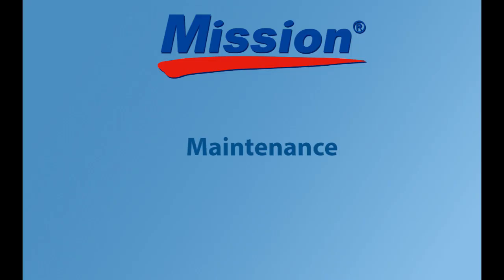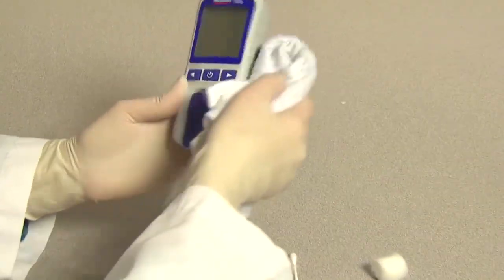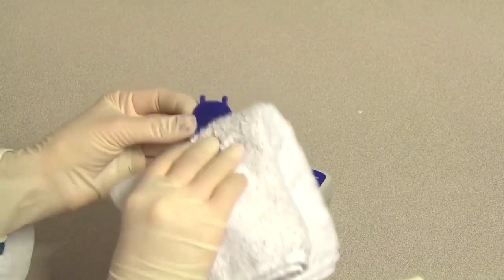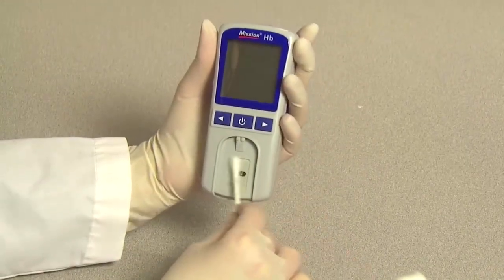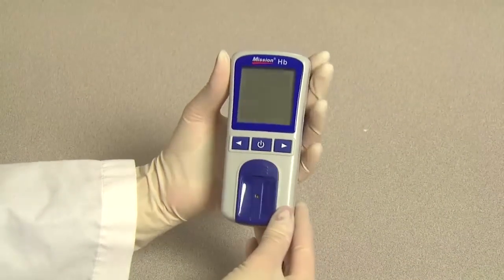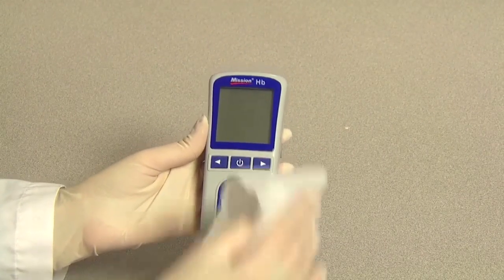Maintenance. For best results, the meter should be cleaned after each day of testing. Clean the meter surface with a dry or damp cotton cloth. Use a dry soft cloth to clean the LCD. Remove the test strip holder by pressing in on the middle of the test strip holder and sliding it out from the meter. Wipe it down with a damp cloth or a mild detergent and dry it with a dry soft cloth. Wipe down the meter sensor area with a cotton swab. Make sure you do not scratch the transparent window covering the sensors. Slide the test strip holder back into the meter. If the meter is used for self-testing on multiple patients, it should also be disinfected before each test to prevent potential infectious disease transmission through bloodborne pathogens.